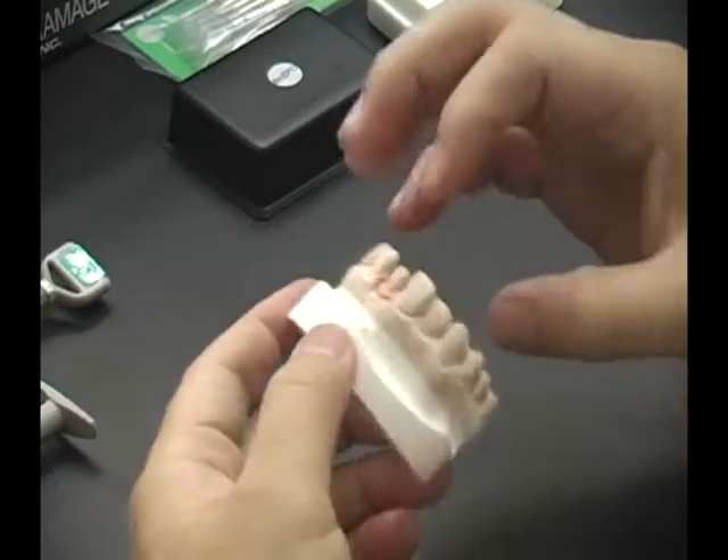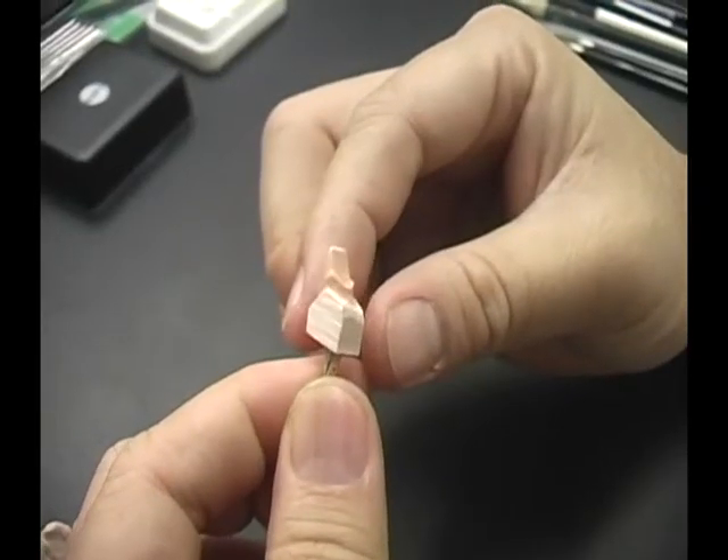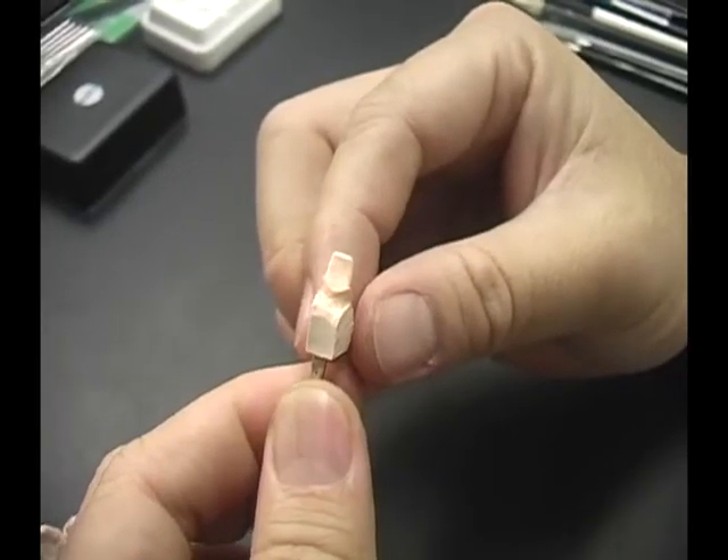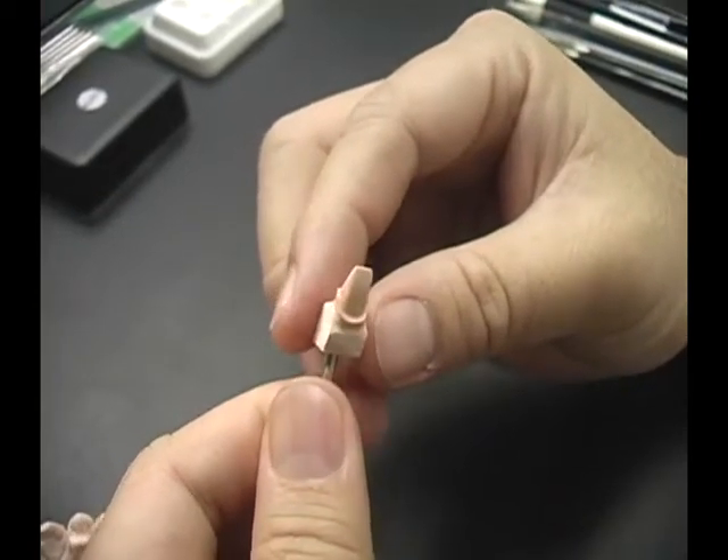Prepare the working model and separate the die. After removing the die from the tray, clean the surface and mark the margin with a red pencil. The prepared die is now ready for fabrication of the single crown.